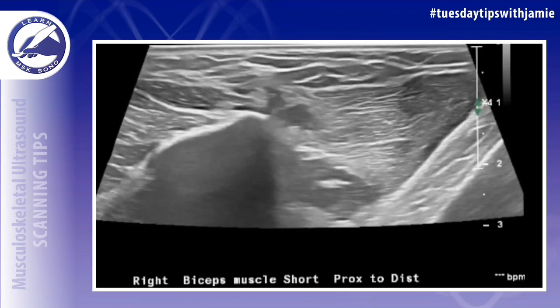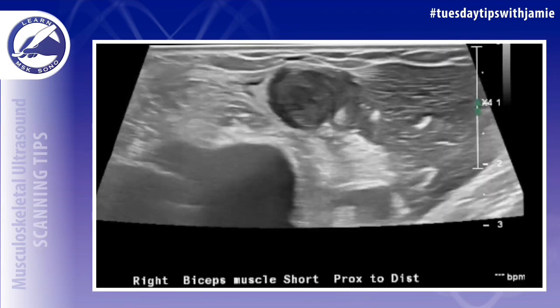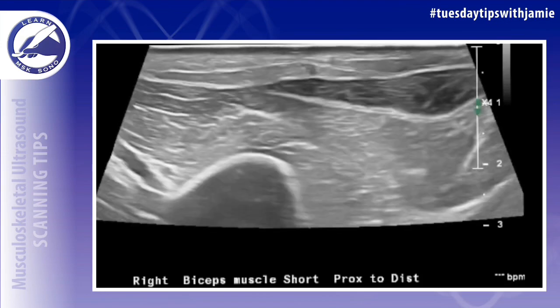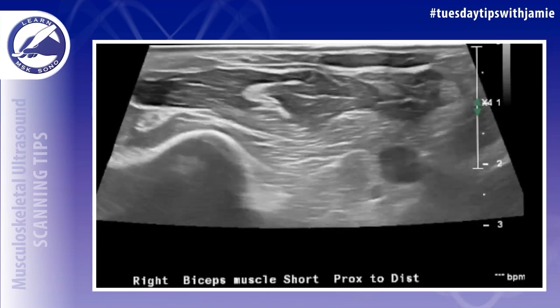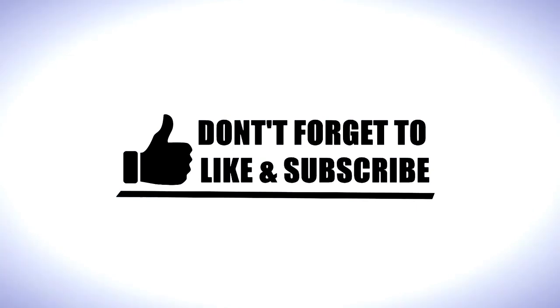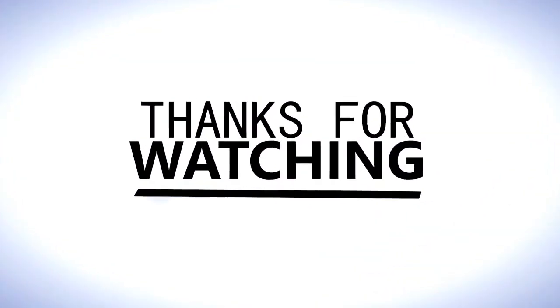You also want to image any retraction of the myotendinous junction. Usually that's at the level of the mid arm — like in this example — that will be just below the pectoralis major insertion onto the humerus. The patient may also present with a Popeye sign in the upper arm when the muscle is retracted. This is a classic clinical sign of this injury.